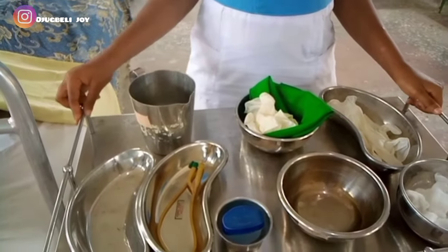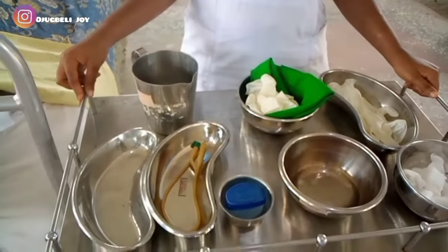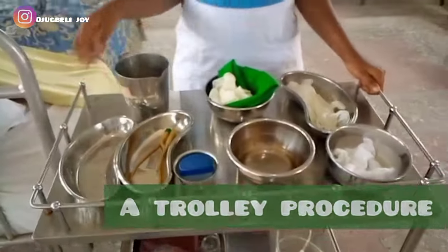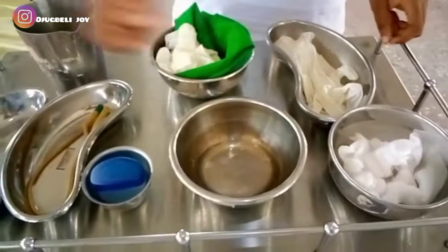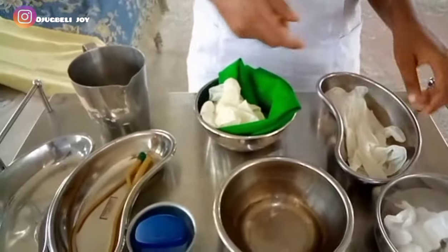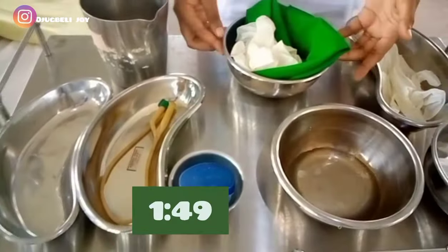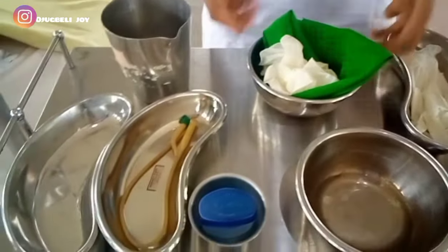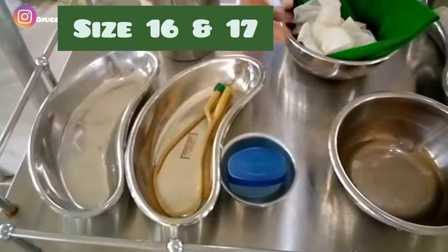Welcome back to today's video. Today's procedure is catheterization. It's a sterile procedure and also a trolley procedure. On our top trolley, we have a bowl of swabs containing gauze swabs and cotton wool, a receiver for gloves containing gloves, a bowl of cleaning lotion — it could be Dettol in the ratio of 1 to 49 — then a bowl containing three sterile towels and a pair of gloves.